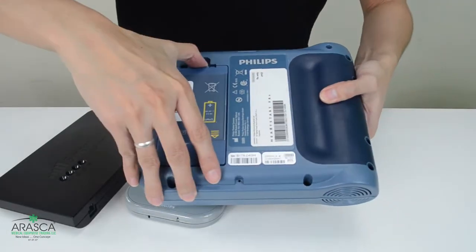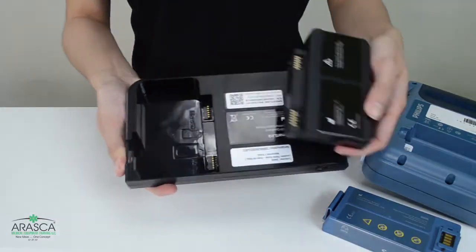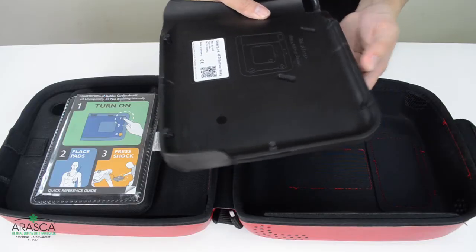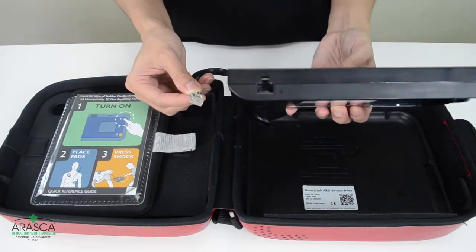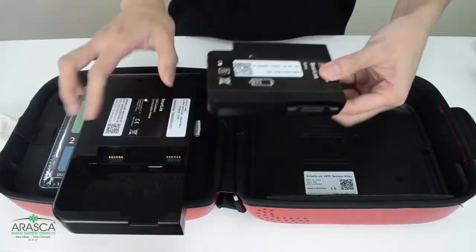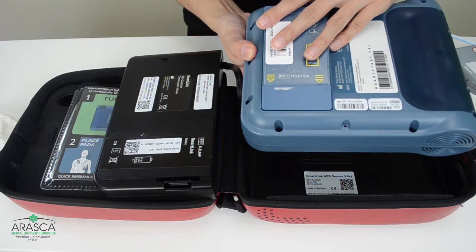To install the SmartLink, simply remove the battery of the AED as well as the SmartLink. Attach the SmartLink inlay inside the carrying case where the AED lays flat. Then connect the inlay cable to the SmartLink and attach its battery. Next, reattach the AED's battery and lay it over the inlay.